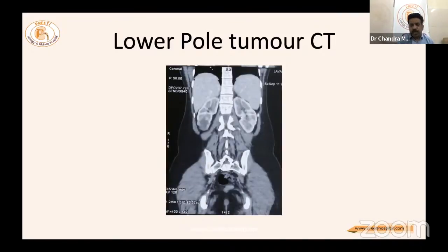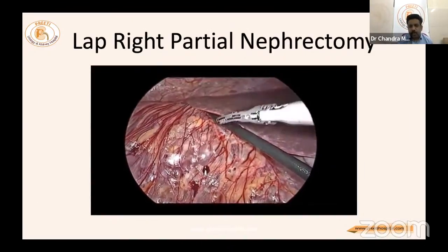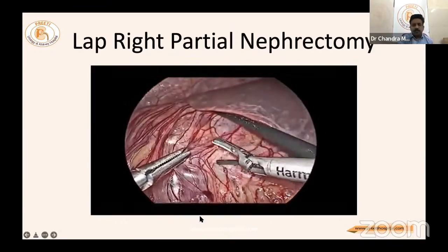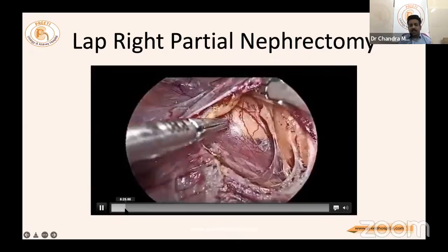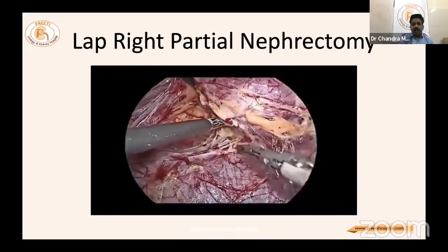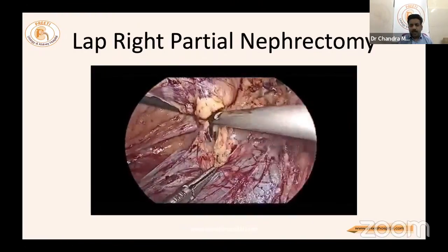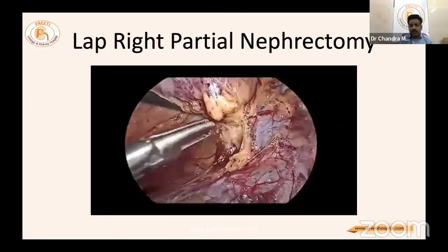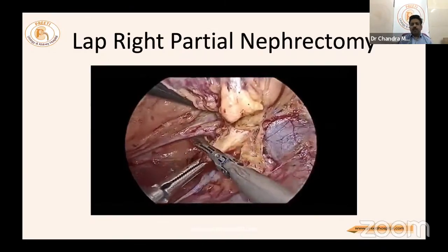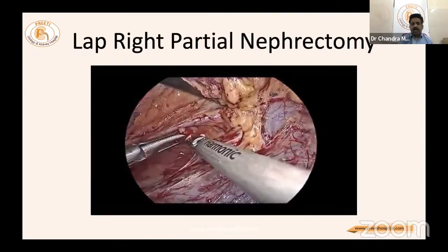Case 4: Another lower polar tumor case on the right side. Initial pneumoperitoneum encountered some omentum. The kidney is lifted on the right side, proceeding cautiously during hilar dissection. On the right side, if any injury occurs to the renal vein, it results in nephrectomy. A 10 mm port on the right is recommended at all times for clipping. Go slow at the angle between the renal vein and the IVC.